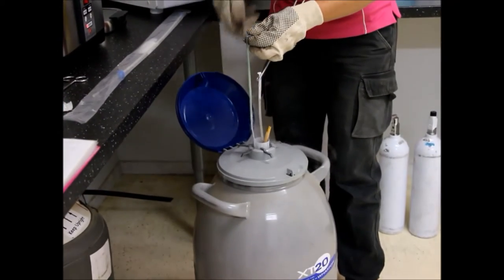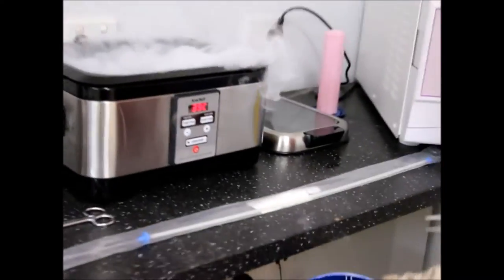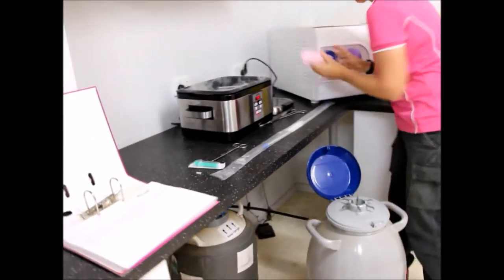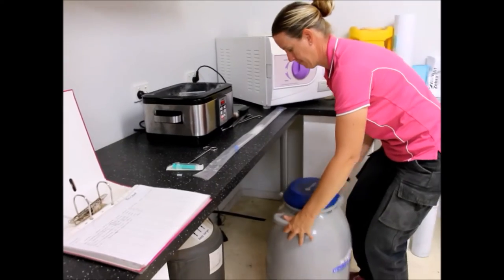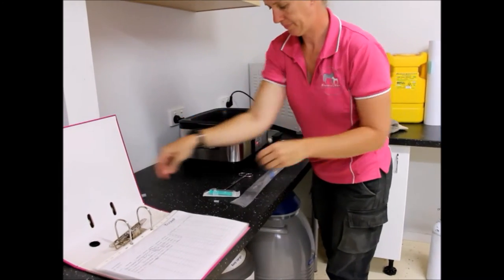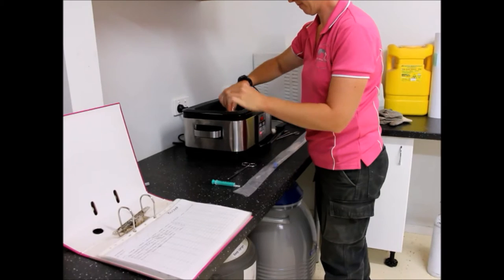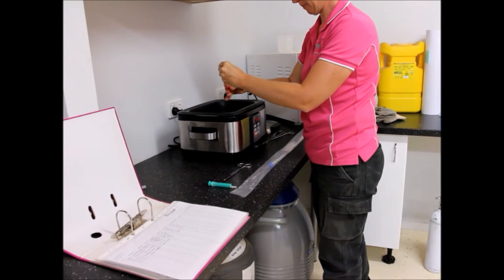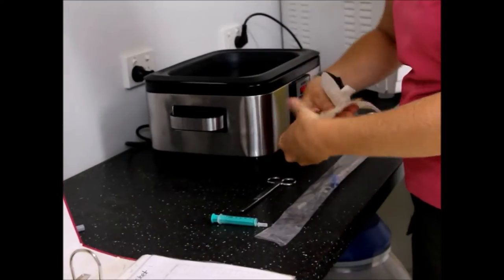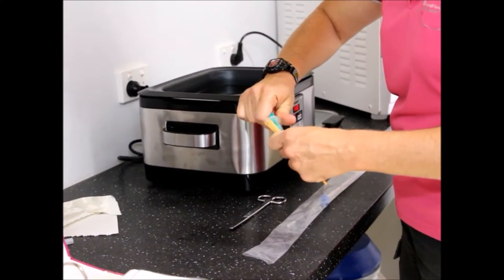You have to be very careful with this — liquid nitrogen can splash and straws can break. We apply the frozen semen into the constant water bath for 15 to 20 seconds, then quickly remove it. We dry the straws and load them into a semen-safe syringe, as latex is harmful to semen and we must use particular equipment. Sperm does not like water — it's spermicidal and will kill the sperm — so we carefully dry the straws and then remove both ends so the semen can be put into the syringe.